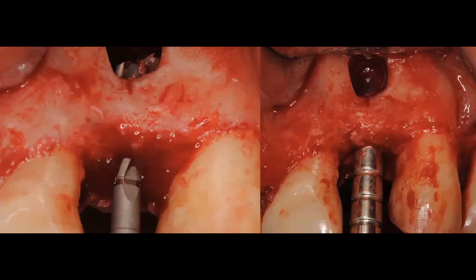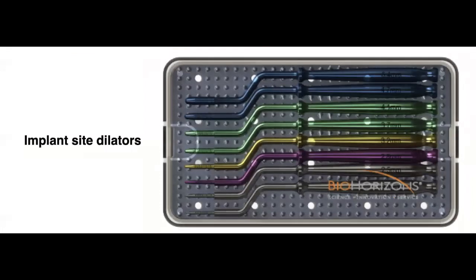We're using a pilot drill on the left-hand side, and you can see that that pilot drill goes right into that area where we are lacking bony tissue due to the large cyst that the patient presented. Once we do that, we're going to use some site dilators. And in this particular case, I used multiple different widths. I think I went all the way up to either 4.0 or 5.0 with a site dilator, just in order for me, again, to push that buccal bone a little bit more facial.